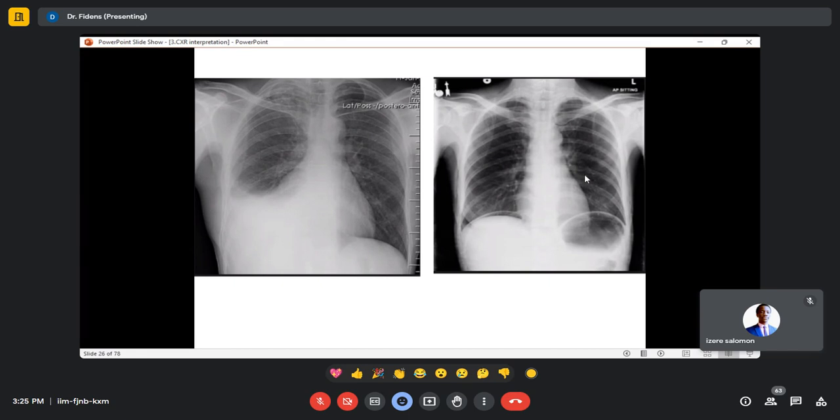Let us go to another image here. Another person, let me see. Rosine, are you here? Where is Rosine?